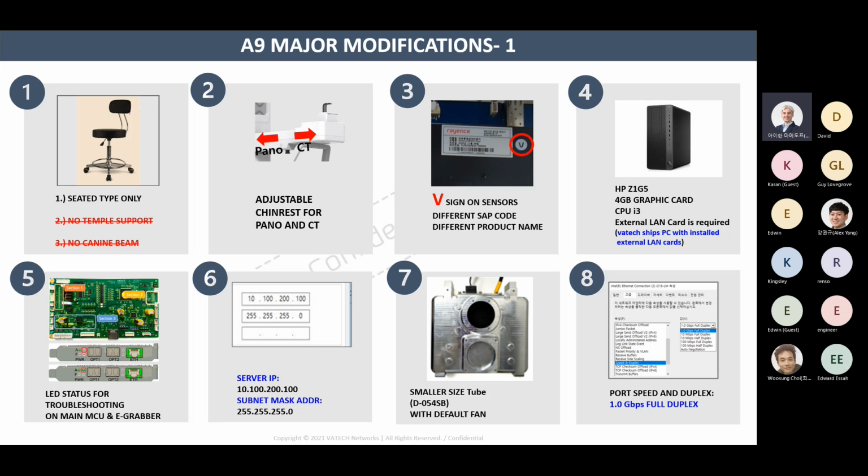In order to use this device, you need external LAN cards. Don't forget it, all right?